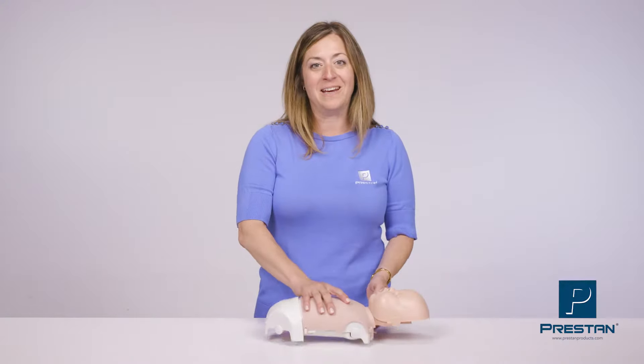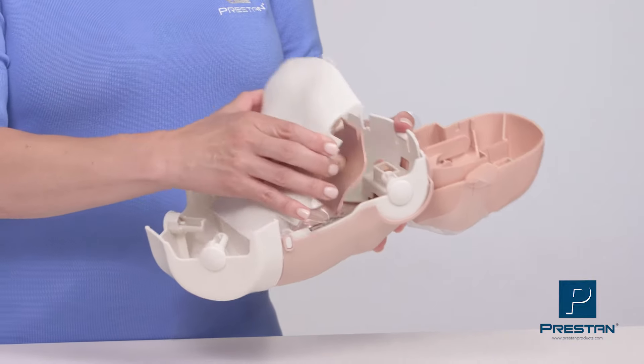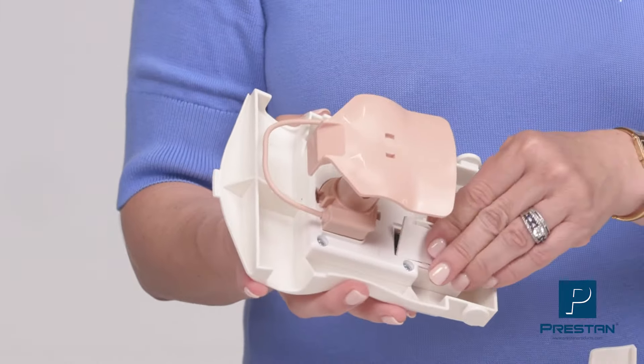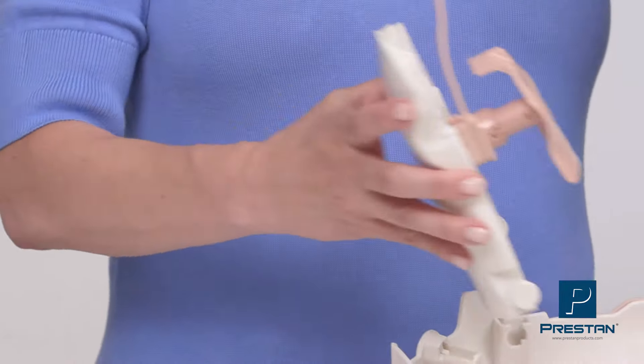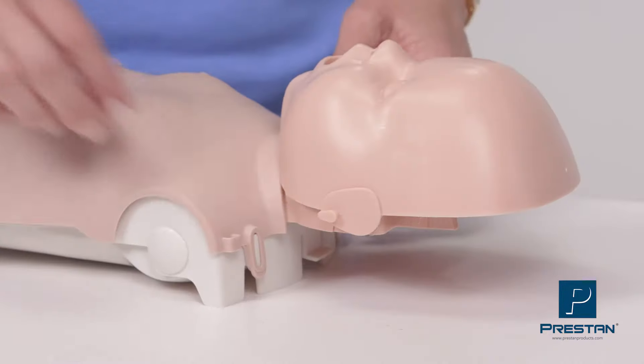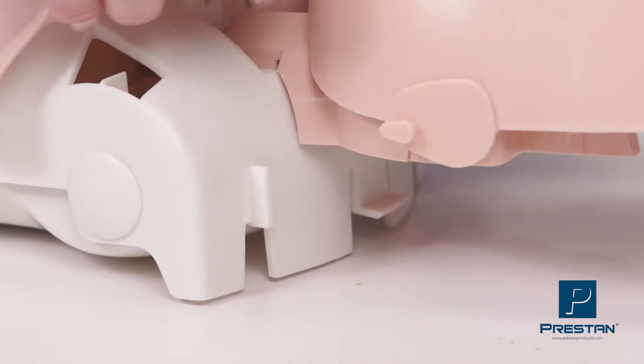The Infant Ultralight is lightweight, portable, and extremely fast and easy to set up and use. Simply unlatch the back panel and rotate it down to install two AAA batteries. Route the LED sensor outside of the mannequin and close the back panel.